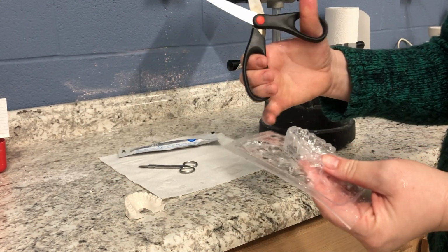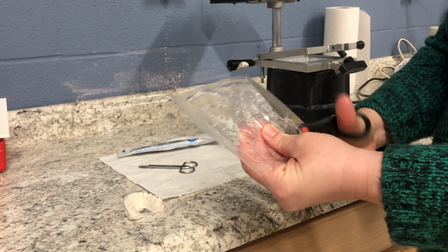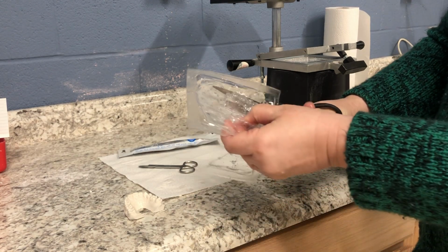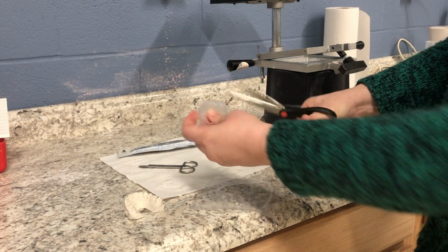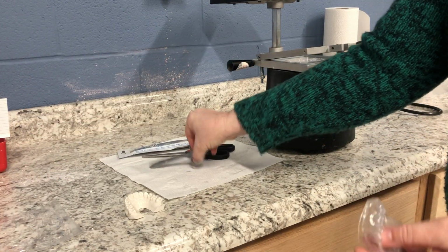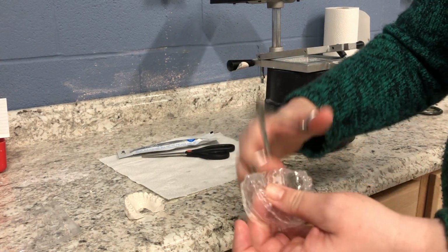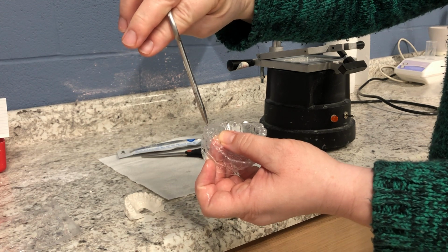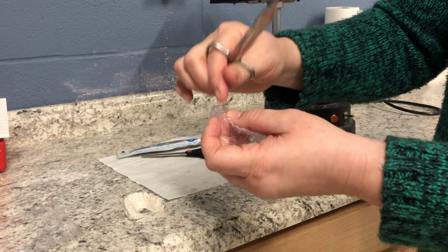I'm going to use the big heavy scissors to do what I like to call an initial cut, so it's easier to handle with the crown and bridge scissors. And then you just discard that. Then you're going to take the crown and bridge scissors. And I like to cut, I don't want to be anywhere on the tissue where if you have swollen tissue, it will rock and not fit well.